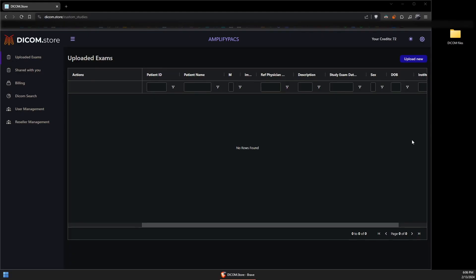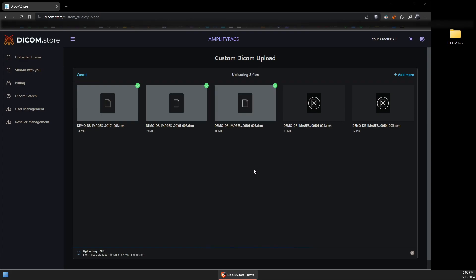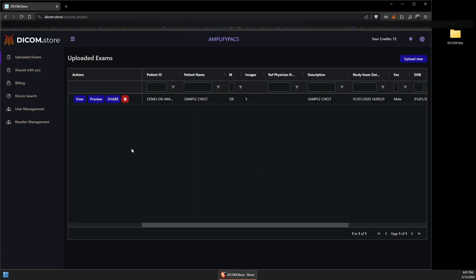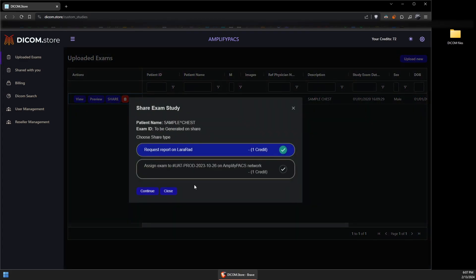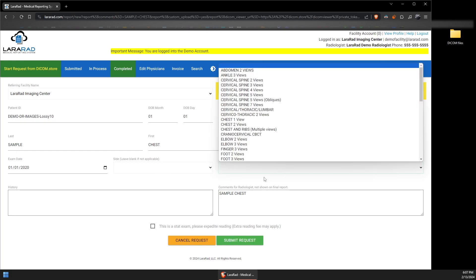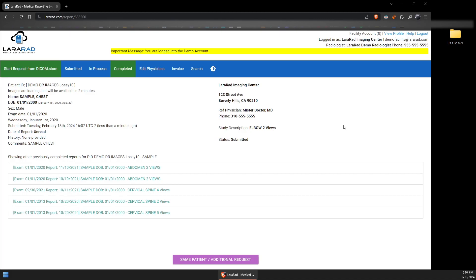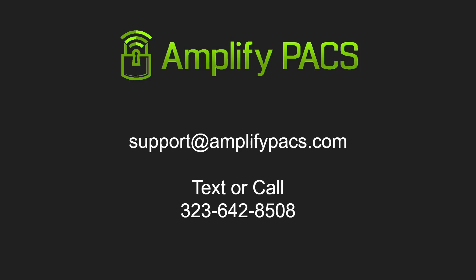For this example, I'll demonstrate using the pay-per-use option. I've already exported the Dicom files and placed them on my desktop. I go to Dicom Store, click Upload New, and click and drag my files over to upload them. Once the process is complete, click Share and Request Report on LaraRed. This will take you to LaraRed. Just fill out the required fields and submit the request, and you're finished.